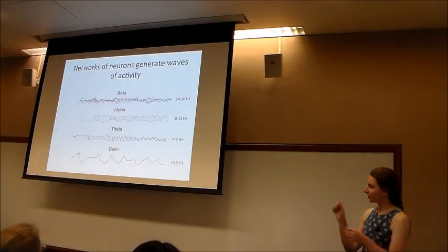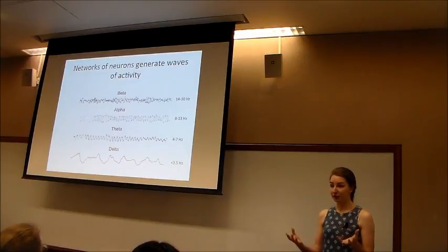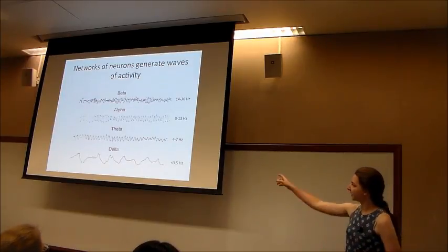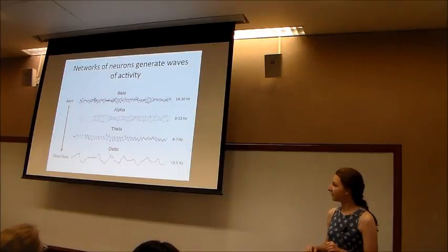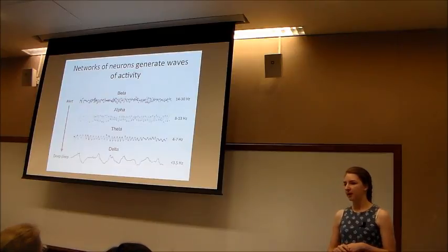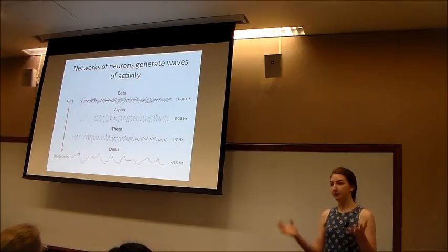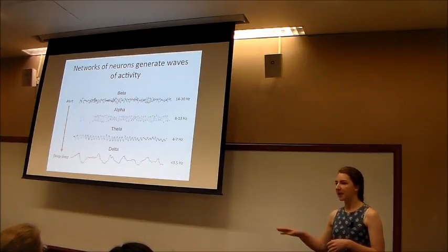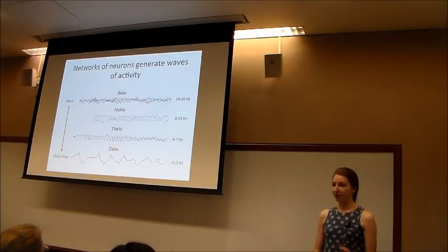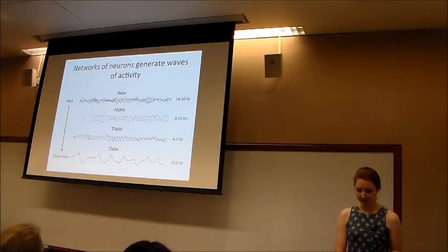Interestingly, the smaller your wave, the more awake you are, and the more conscious activity you're doing. And the slower your wave, the more unconscious you are. The very smallest wave at the top is called the beta wave, and that means you are awake and maybe doing some problem solving. Whereas the alpha wave means you're still awake but probably at rest, maybe meditating, and your waves have slowed down because your neurons have become more synchronous. Then a theta wave means you're becoming unconscious, maybe at the beginning of sleep, and a delta wave is when you're in very deep sleep and not dreaming, so there's very little activity going on in the brain. It has just all synced up together.